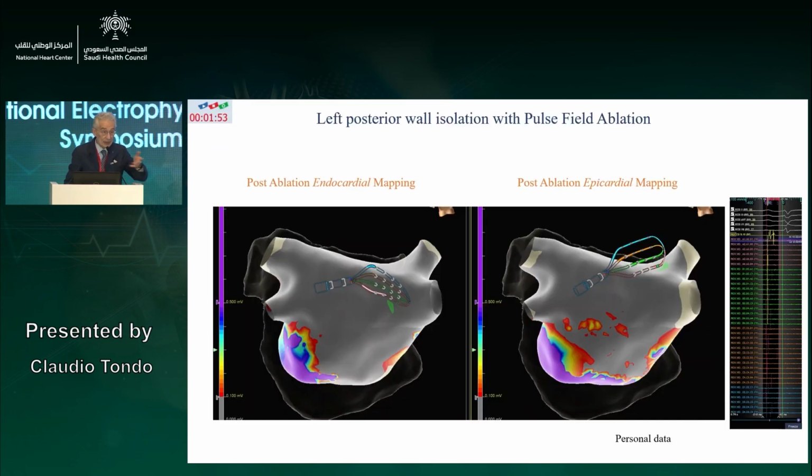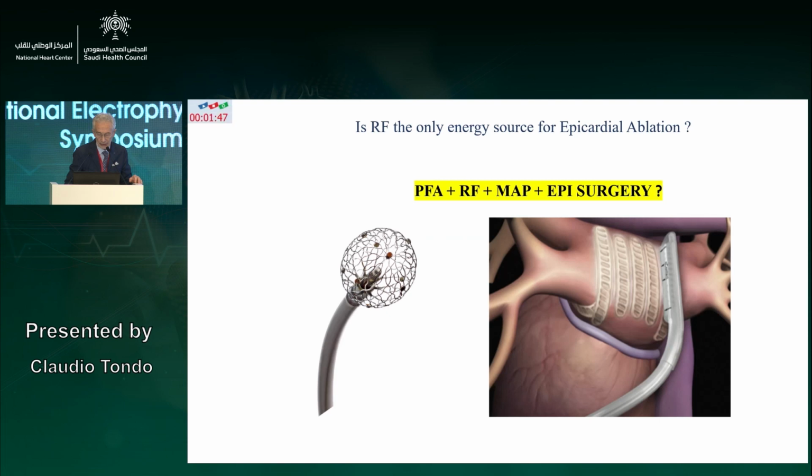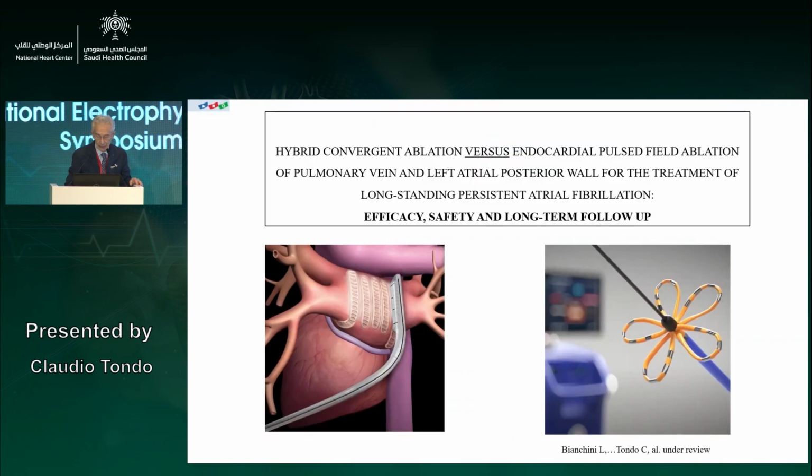So I think this is the same case that I presented before. We need to go beyond, and just before my final remarks, we might think that in the near future, if you consider hybrid ablation, you might use PFA instead of RF, even for epicardial.